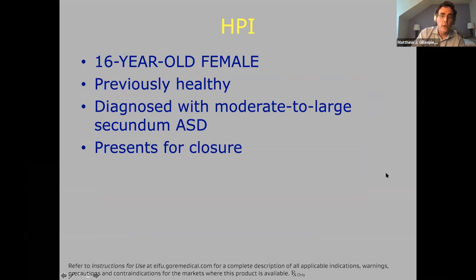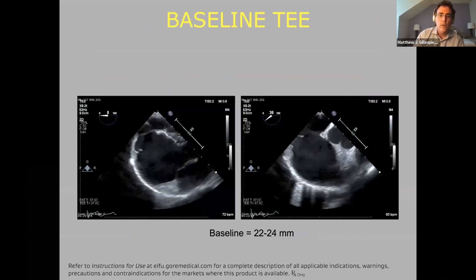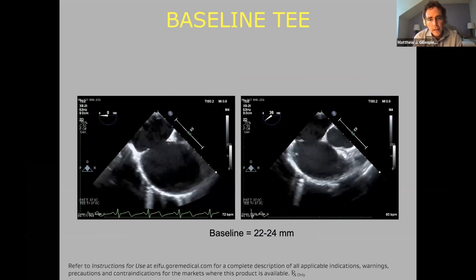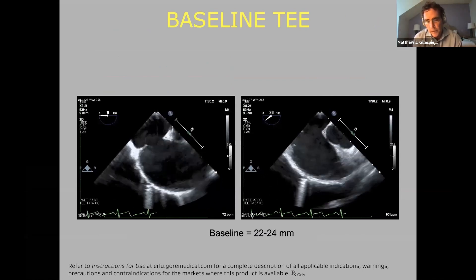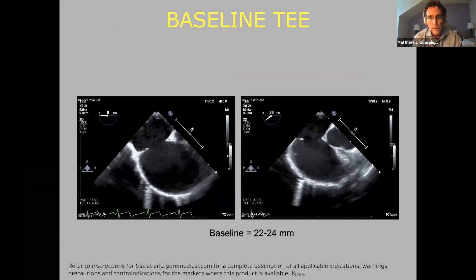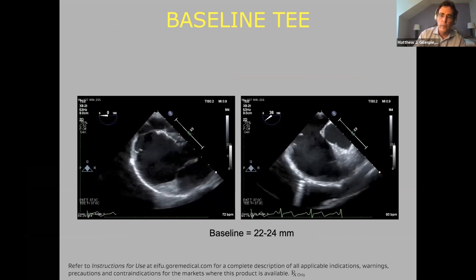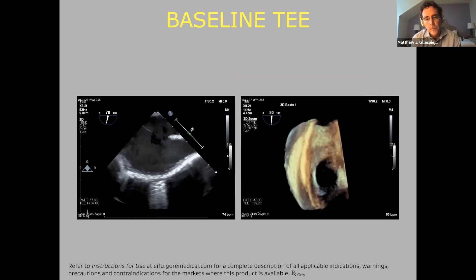This is a 16-year-old female with an unremarkable story, diagnosed with an ASD who came in for closure. This is her TEE, and in various views it measured between 22 and 24 millimeters with moderate RV dilation.